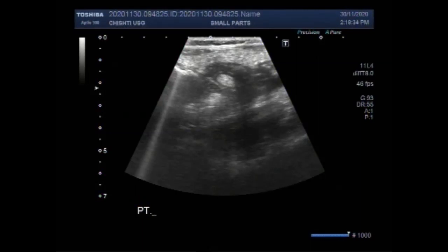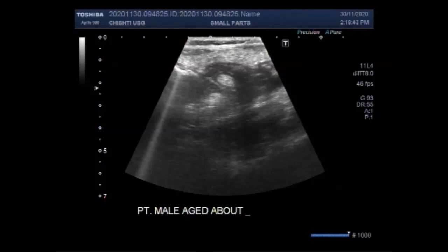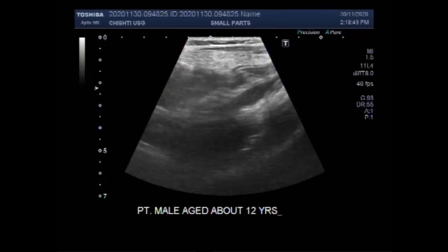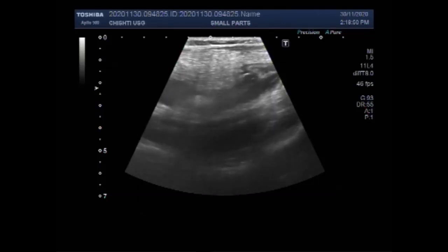I hope you are all fine. This ultrasound video shows a fecolith in an inflamed appendix. The patient is a male child aged about 12 years.